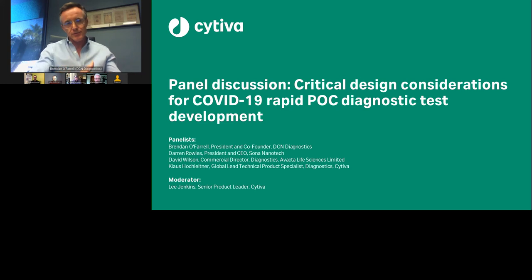Starting from the concepts of designing really usable tests for point of care application, which covers everything from getting the right sample to getting the test to run correctly, to making sure it can be interpreted correctly digitally or by eye, to the analytical challenges of just making the system work, selecting the right reagents, getting the right materials, ensuring that everything, as Darren and David said, goes through the correct process and goes through it correctly, ultimately ending up in a properly validated product that can then be scaled and manufactured, right? So all of those challenges still exist here, but as I say, obviously we're trying to compress this timeline.